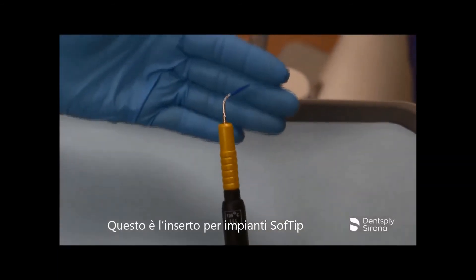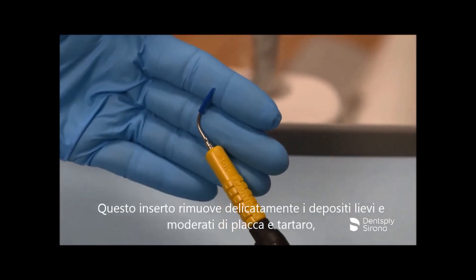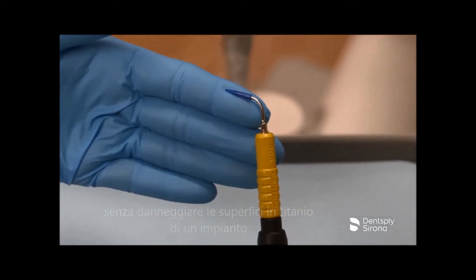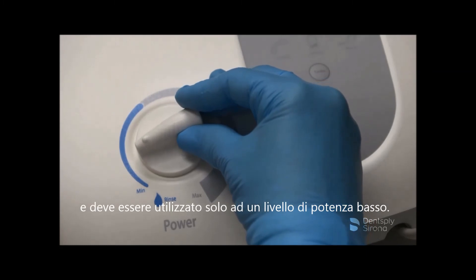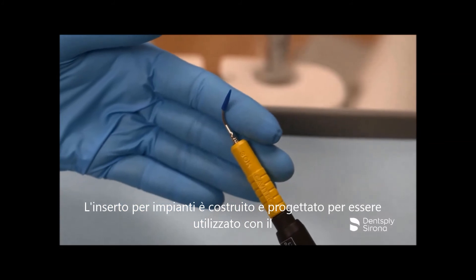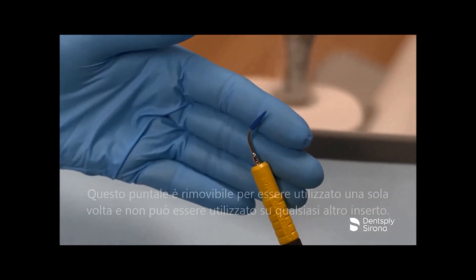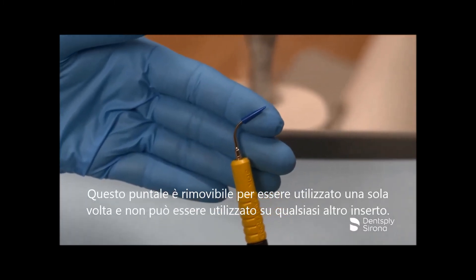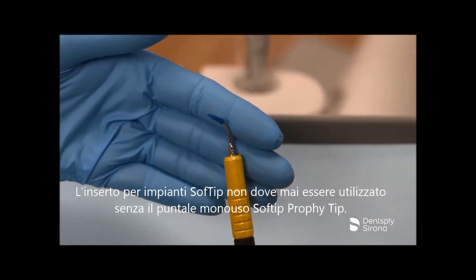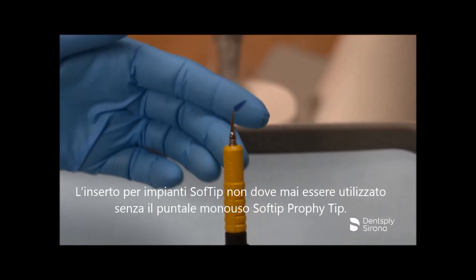This is the Cavitron Soft Tip Ultrasonic Implant Scaler. This insert gently removes light to moderate plaque and calculus without damaging implant titanium abutment surfaces and should only be used at low power level. The implant insert is manufactured and designed to be utilized with the corresponding Soft Tip Disposable Prophy Tip. This tip is removable for one-time use and may not be used on any other insert. The Cavitron Soft Tip Ultrasonic Implant Insert should never be used without the Soft Tip Disposable Prophy Tip.